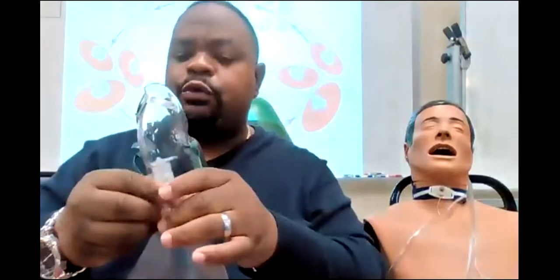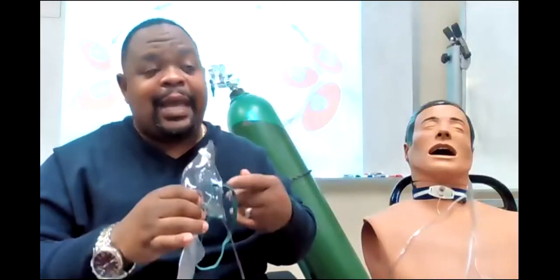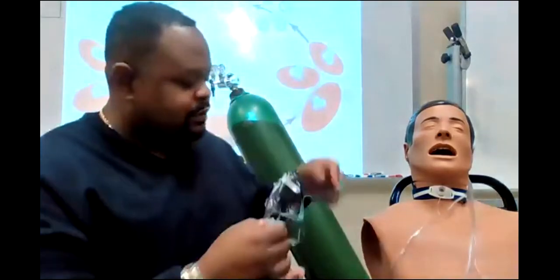So when you have a question, you notice Mr. Smith is on a non-rebreather or a partial rebreather mask. And every time he inhales, the bag collapses. What should you do? The answer is increase the flow. Okay? So this is what it looks like.